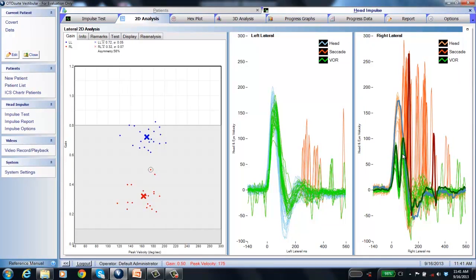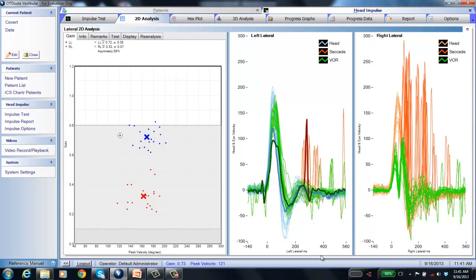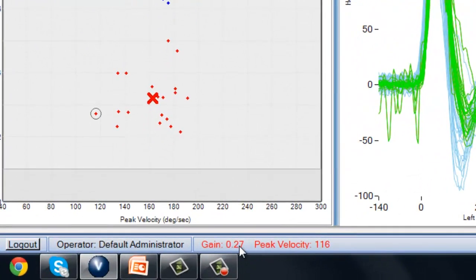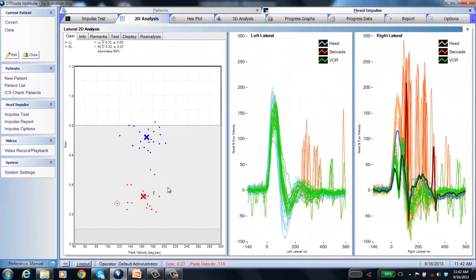In the gain graph, the circled gain point corresponds to each individual trace. The gain for one impulse shown is 0.27, and the peak velocity for that particular head impulse was 116 degrees per second — that's how quickly the head was moved. The asymmetry was 56%, showing significant difference between the right and left sides.